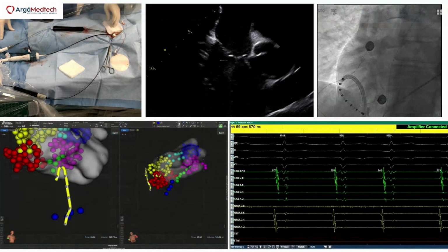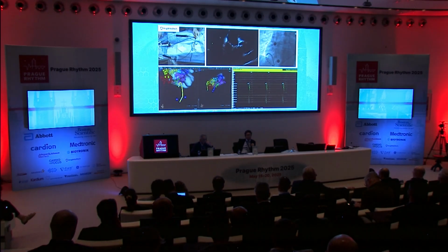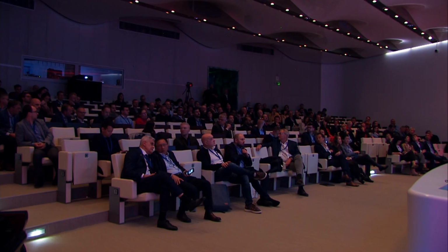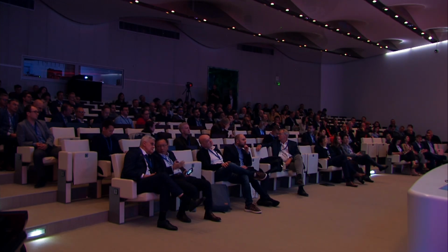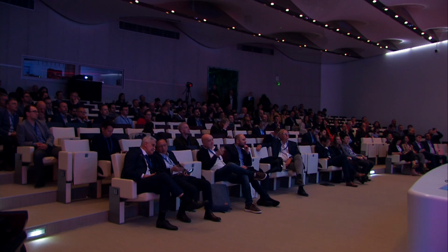Any questions? There is one question. We wanted to show you a lot, but that's why we're quite quick. Thank you for the case, very interesting. I have one question about the configuration of PFA for the isthmus. Do you apply the same energy as in the pulmonary veins? And why does it function, because we have quite different tissue that we ablate. Do we have the same results for CTI as in PFA in terms of long-term isolation?